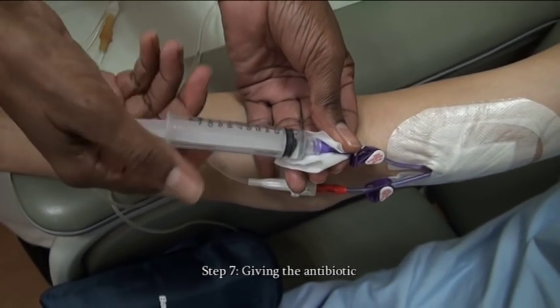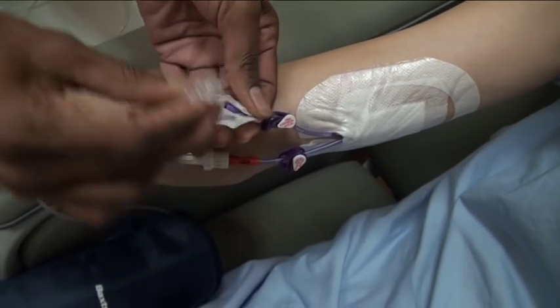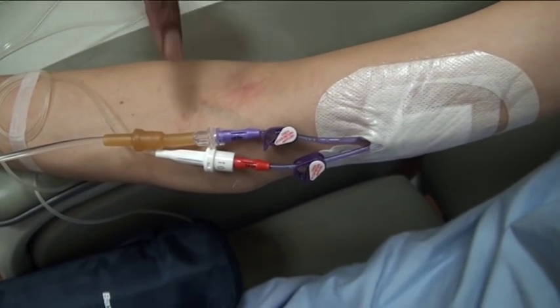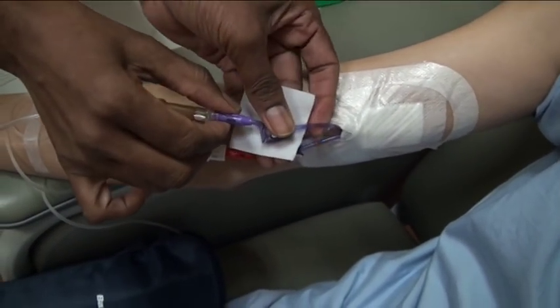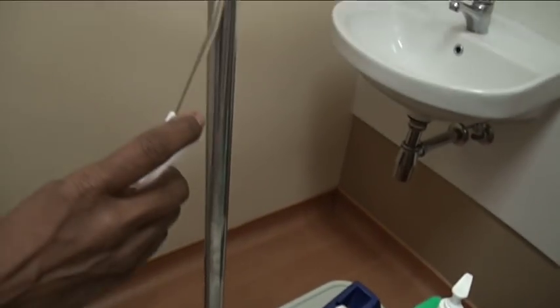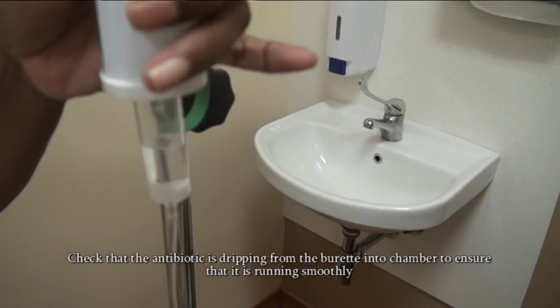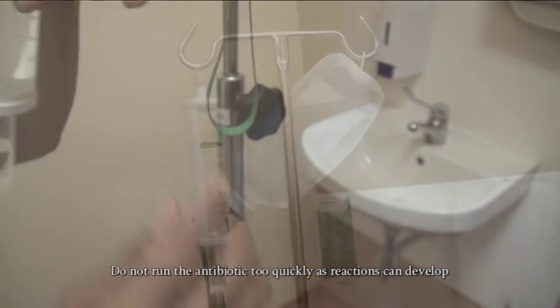Step 7: Giving the antibiotic. Remove the syringe from the port. Uncap the drip line and connect the drip securely to the port. There should be no leakage at the connection site. Unclamp the PICC line. Unclamp the bottom clamp of the lower line. Check that the antibiotic is dripping from the burette into the chamber to ensure that it is running smoothly. Do not run the antibiotic too quickly as reactions can develop.